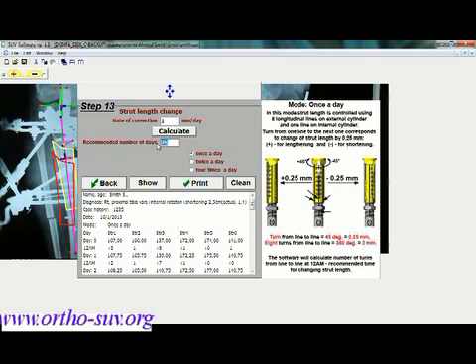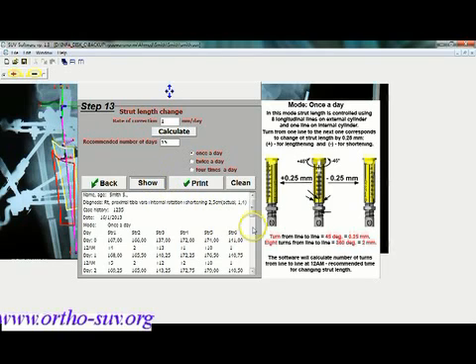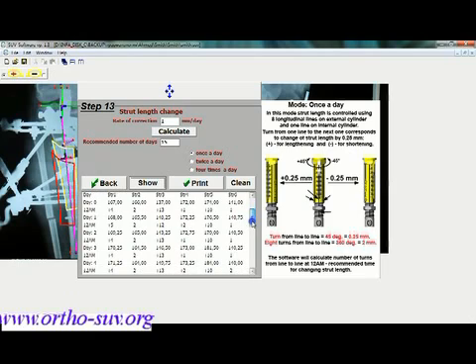If you disagree with the software and you don't want to make deformity correction in 26 days, you can choose another number of days according to your orthopedic decision, but it will be your responsibility. In this case, we inserted 15 days.